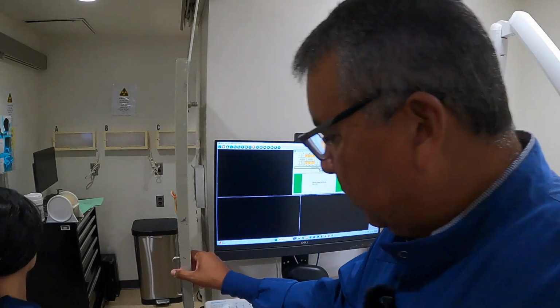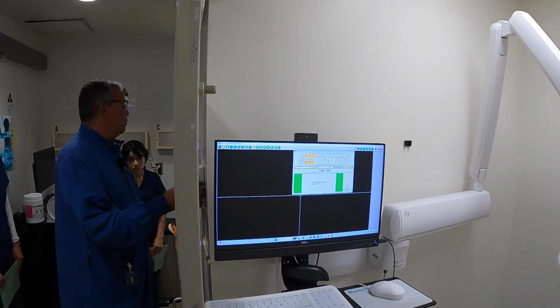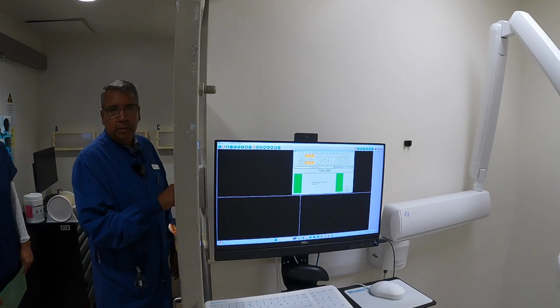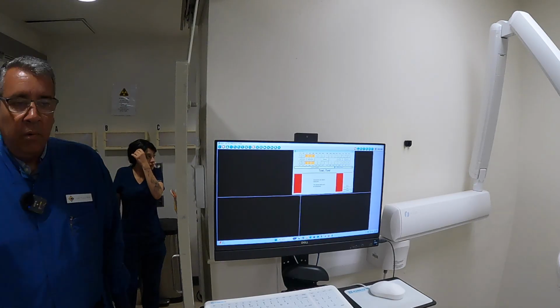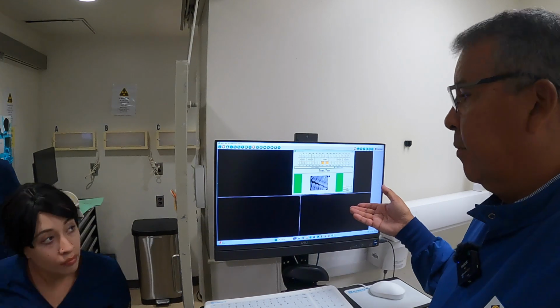So I'm going to go ahead and close this. I'm going to go ahead and press the dead man switch. It's on bite wings. It's on digital, so we're all good. Press and hold. And then I'm going to go ahead and walk back into the room. And your x-ray came up, okay?